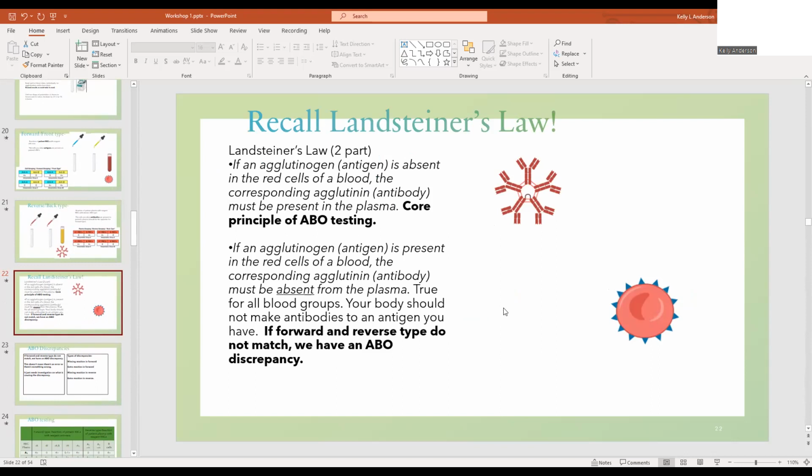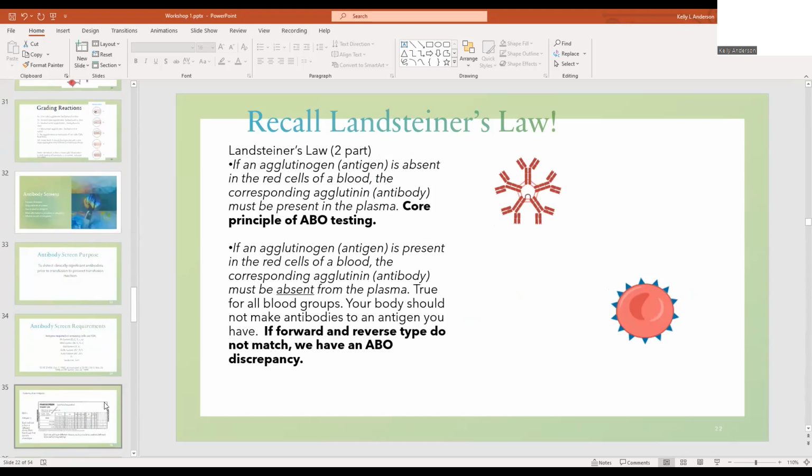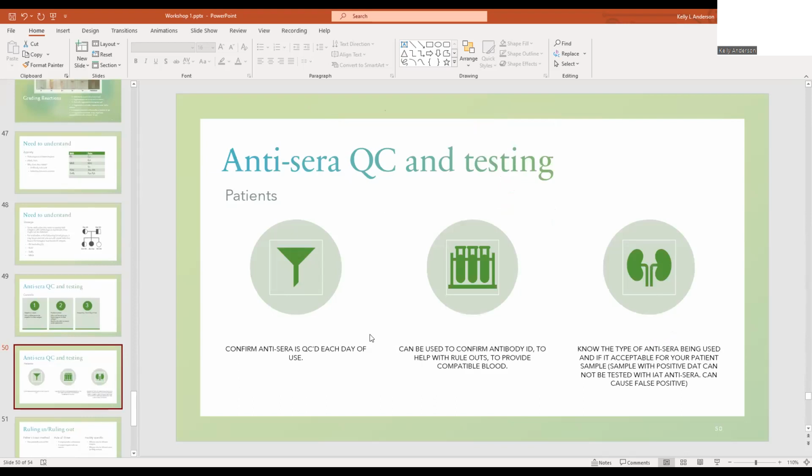So if I have an anti-big C, I cannot be big C positive. I should not be making an antibody if I am positive for that antigen. You don't want your body to attack itself. So a really nice thing about phenotyping your patient is you can use that basically as a rule out when you're doing antibody IDs.